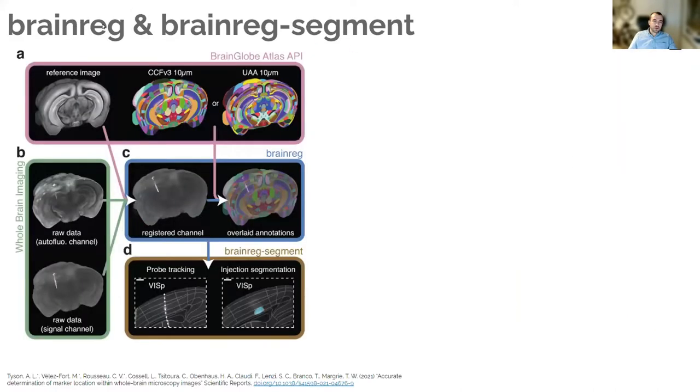The tools I'm going to talk about are part of the BrainGlobe ecosystem of tools. There are two tools that are relevant here. One is BrainReg, which is this 3D atlas registration tool that will warp your sample to an atlas space and also allow you to segment your brain based on atlas annotations. And BrainReg-segment, which is a general purpose bulk structure segmentation tool that wasn't built specifically for Neuropixels probes but can be used to segment them.